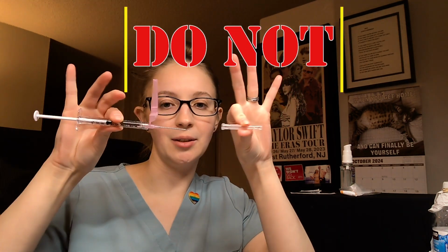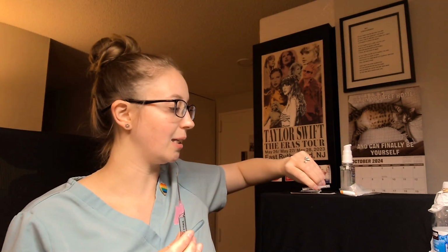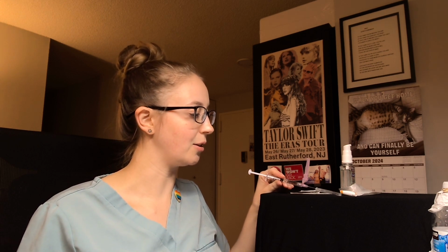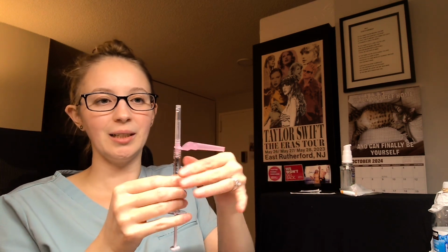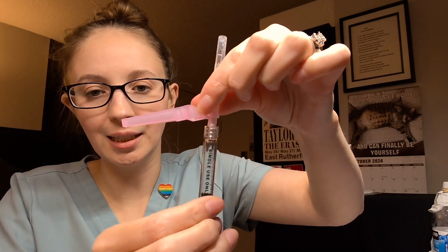In my case, I'm planning on reusing this needle for demonstrations, so I'm going to put the original cap on, not the safety cap. Never cap a needle like this. This is how you poke yourself. You should always cap a needle one-handed. So set the cap on your desk, and then using one hand, guide the needle into the cap until the sharp part is covered. Then you can bring in your other hand and snap it closed. Similar to how we got it on, you're going to take this off just by rotating it and pulling up.